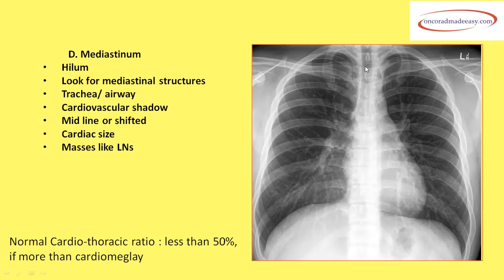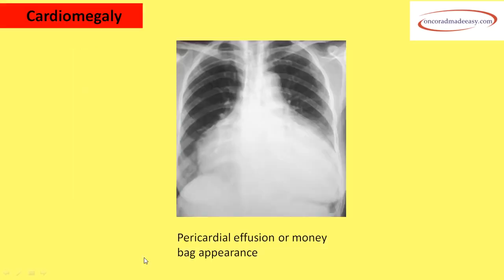Moving more inwards, we look at the hila and mediastinum. In the mediastinum, look for the trachea, the bronchi, the cardiovascular shadow, any midline shift, the size of the heart, and any masses such as lymph nodes. The normal cardiothoracic ratio is less than 50%; if it is more than 50%, it is termed cardiomegaly.